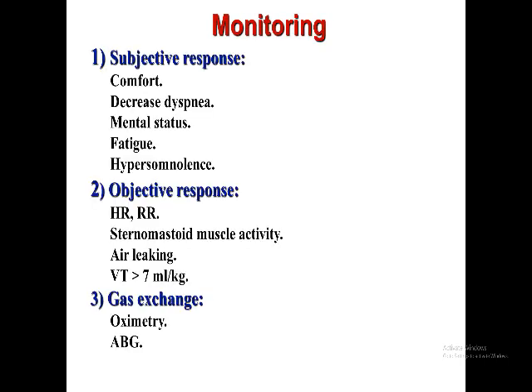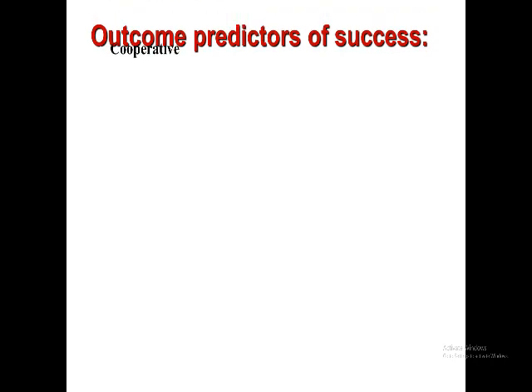I have to monitor non-invasive ventilation. We have subjective response, objective response, and gas exchange abnormality. Subjective response from the patient: ask the patient, are you comfortable? Is your dyspnea decreased? What you see: mental status of the patient, fatigue, hypersomnolence. Objective response: heart rate, respiratory rate, sternomastoid activity, air leaking, tidal volume, gas exchange, oximetry, and arterial blood gas.